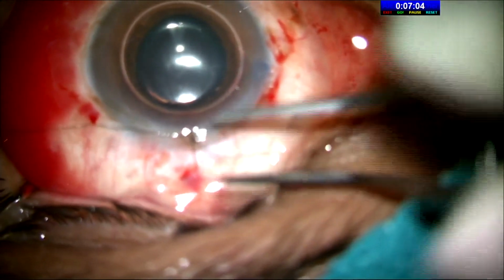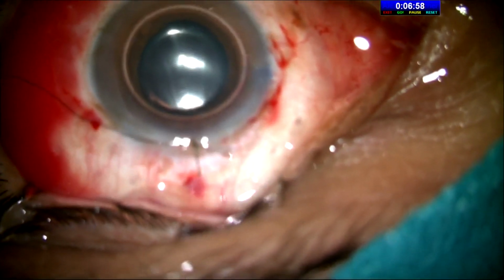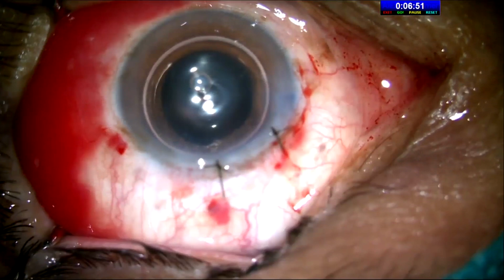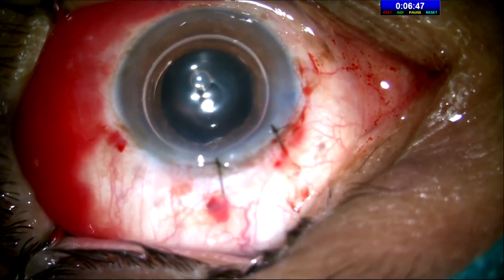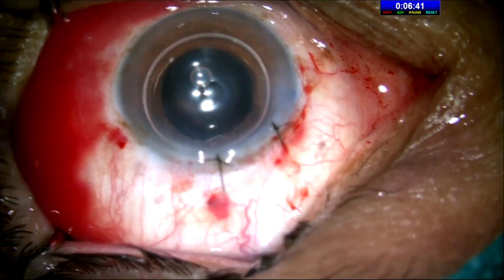I was doing 8-0, then 10-0, then 8-0, 10-0, alternate 10-0, alternate 8-0 and alternate 10-0. That will control it, as one will produce hypermetropia, one produces myopia. So if you do alternate 8-0 and alternate 10-0, that also is good. But with these 2 8-0 sutures, you can remove them at the first operative follow-up, which you do at 9 or 10 days.